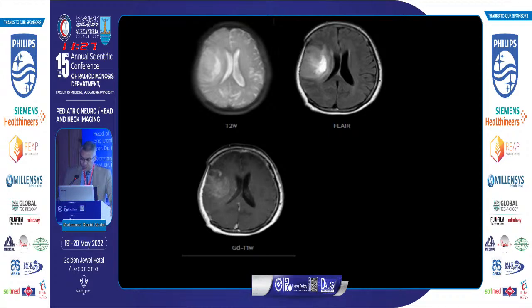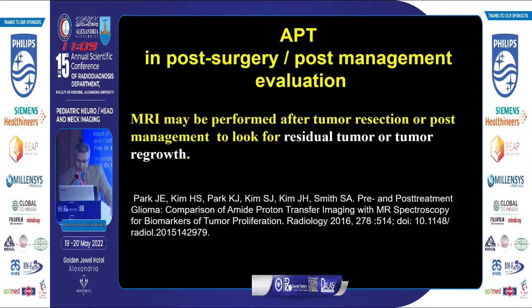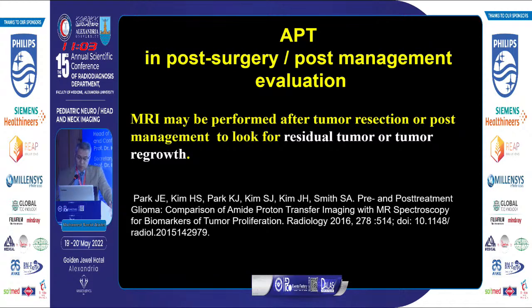A well-defined lesion showing heterogeneous enhancement within the right frontal lobe associated with mild peripheral edema and mass effect — the amide proton transfer revealed high signal within the lesion, consistent with a high-grade neoplasm. The final diagnosis was glioblastoma multiforme.